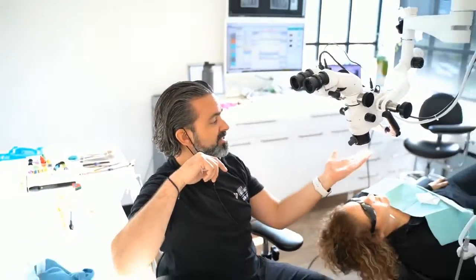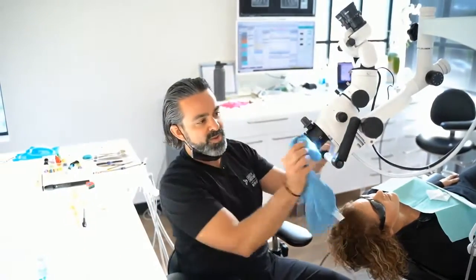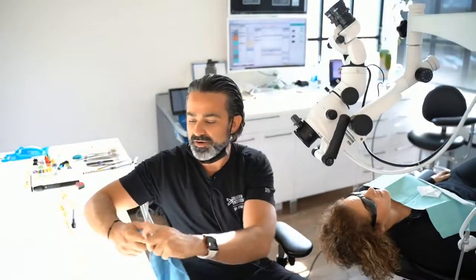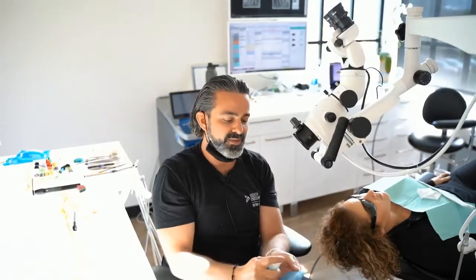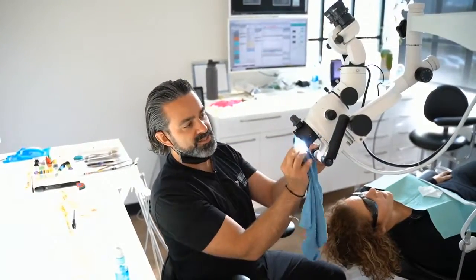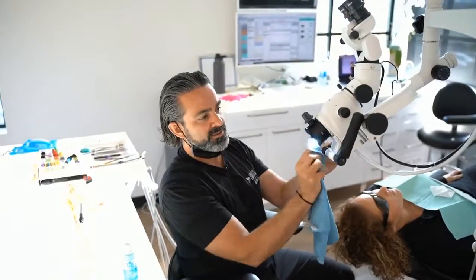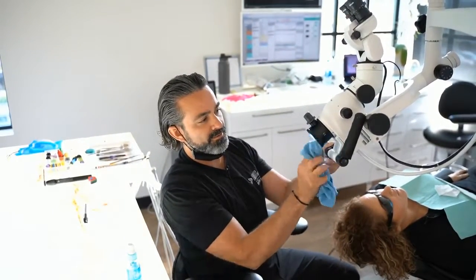Underneath, under the lens here, isn't that important because your assistants are always spraying water. And again, you can put a bag filter over it, but then at higher magnification, you can kind of see the bag or the cap. They make disposable devices, but you can take this and clean it like so.